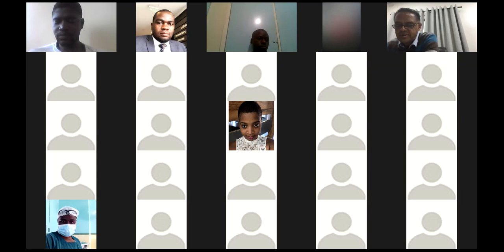Coming to surface replacements in the Crowe classifications, you can use the Birmingham type resurfacing. And certainly the proponents of Birmingham hip replacements have used that a lot, but usually only when the acetabulum is reasonably covered and the femoral head is well within the acetabulum. So that can be used if you consider that hip to be hip preservation. I think anything more than that, you need to go into a standard hip replacement.